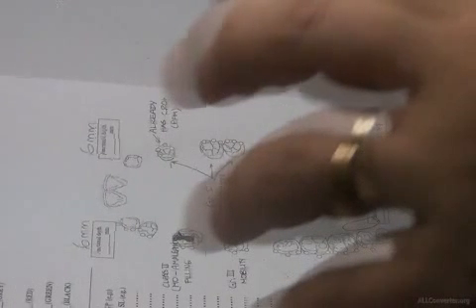Okay. There's one point left to explain, and the other designs I go by them quickly. I don't need to go in details. Of course, in this case we don't need cross arch stabilization, it is already there by having two saddles on the other side. Indirect retention is also available. I'm going to go into the point about mobility, and I'm going to speak about some of the mouth findings.